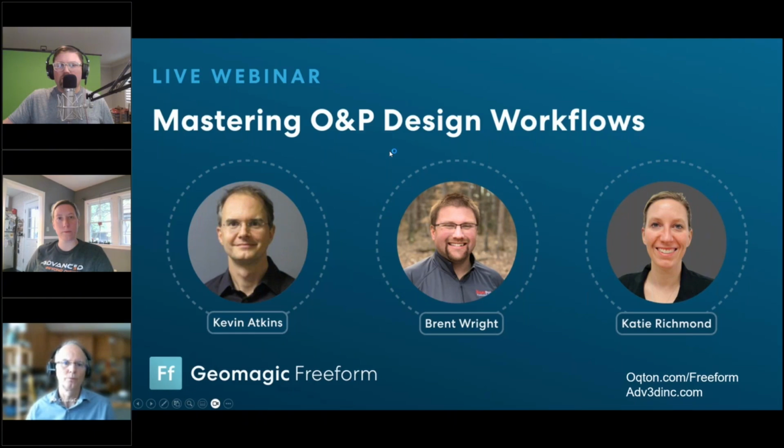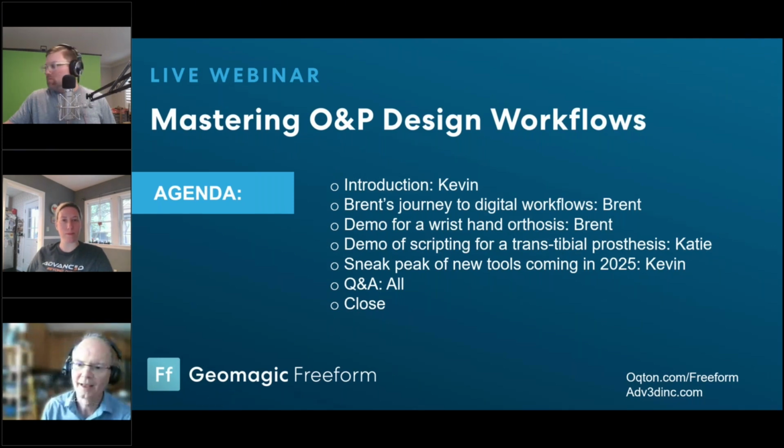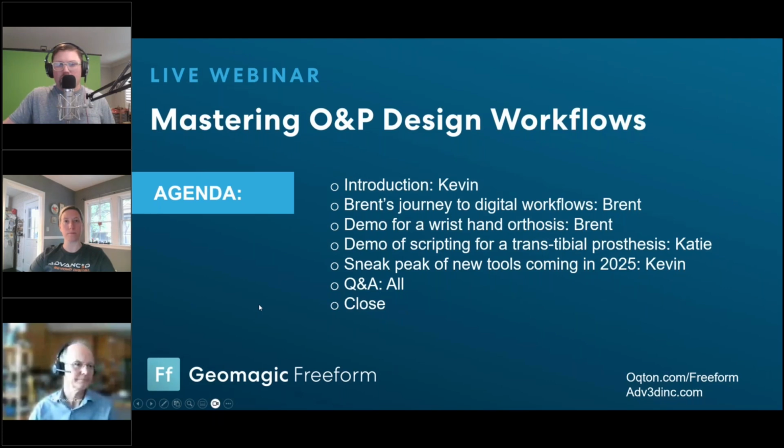Just one or two little things: the agenda. First, we've got the introduction I'm doing now. Then we're going to go through Brent's journey to digital workflows, and then we'll go into some demos. First, Brent will demo a wrist hand orthosis. And then Katie will get into scripting for a transtibial prosthesis. Then I'll do a quick demonstration of some of the new tools coming in Freeform version 2025, and then we'll have the Q&A and close.